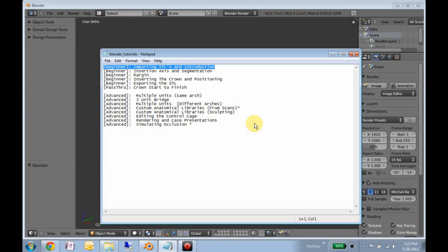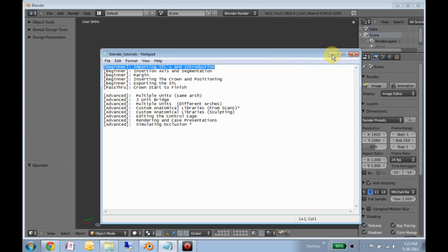This is the Importing STLs and Introduction Tutorial for the Dental Design Tools for Blender. This is a beginner tutorial, which means it is slow, thorough, and wordy.